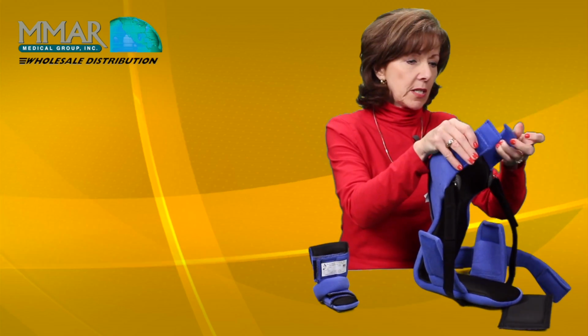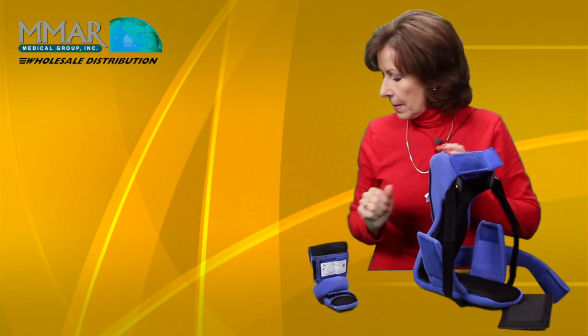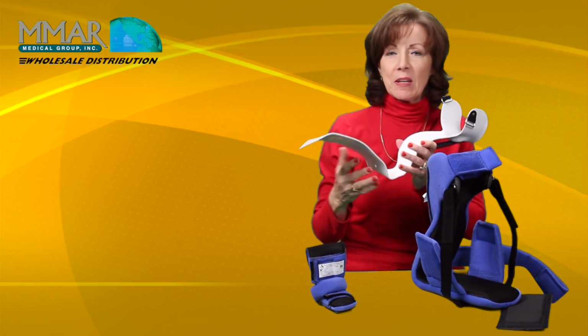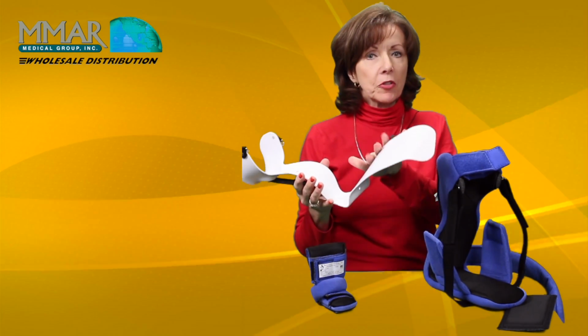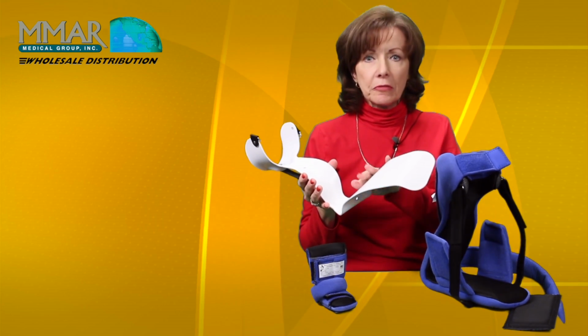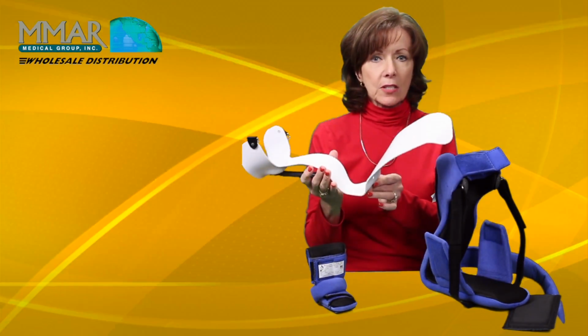Now, if you need to mold this boot, here is the plastic that's inside this boot, and this is a very common mold. Now again, if you're this severe, I would not do the FootEase, I would go to Flex Boot, but I wanted you to see how easy it is to mold.